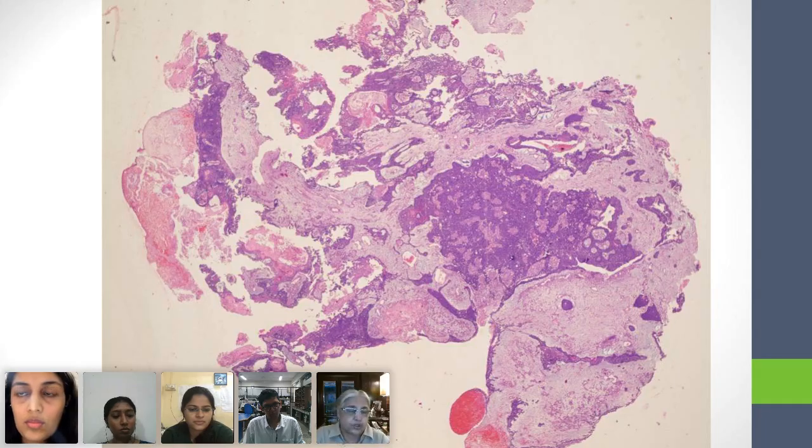Like he was writing notes. You tell me, what notes would he write? Ma'am, some mass coming maybe from the maxillary sinus protruding down in the fistula, and that can be seen when the patient opens his mouth. Right. So when you say mass, what do you mean, Kshitija? Ma'am, it is a huge thing. Now you can see what has been actually taken out, right? So what was it like? Maybe a fleshy mass. Yes, so it's a fleshy mass that is protruding through this oroantral fistula, right?